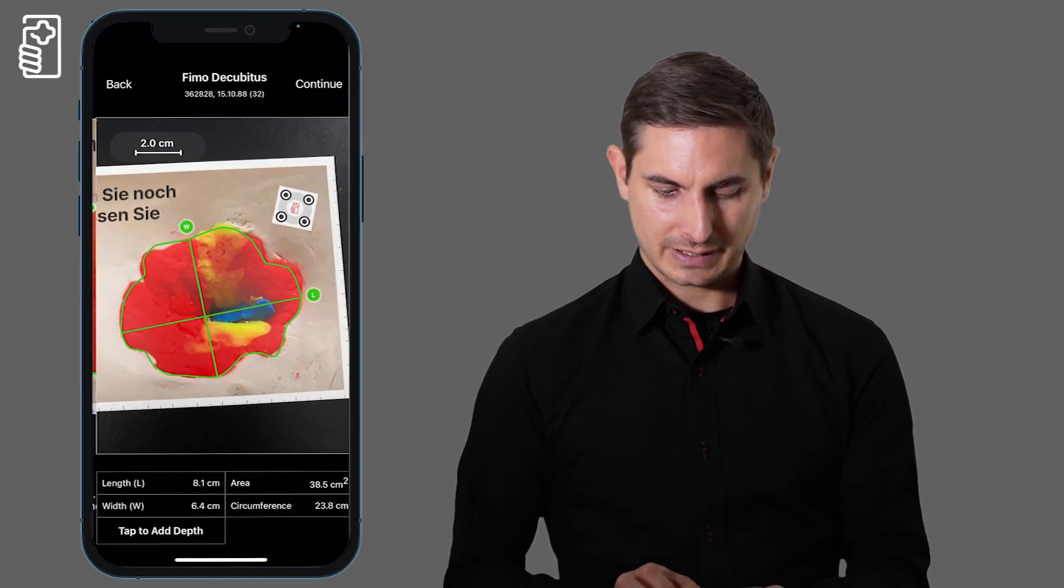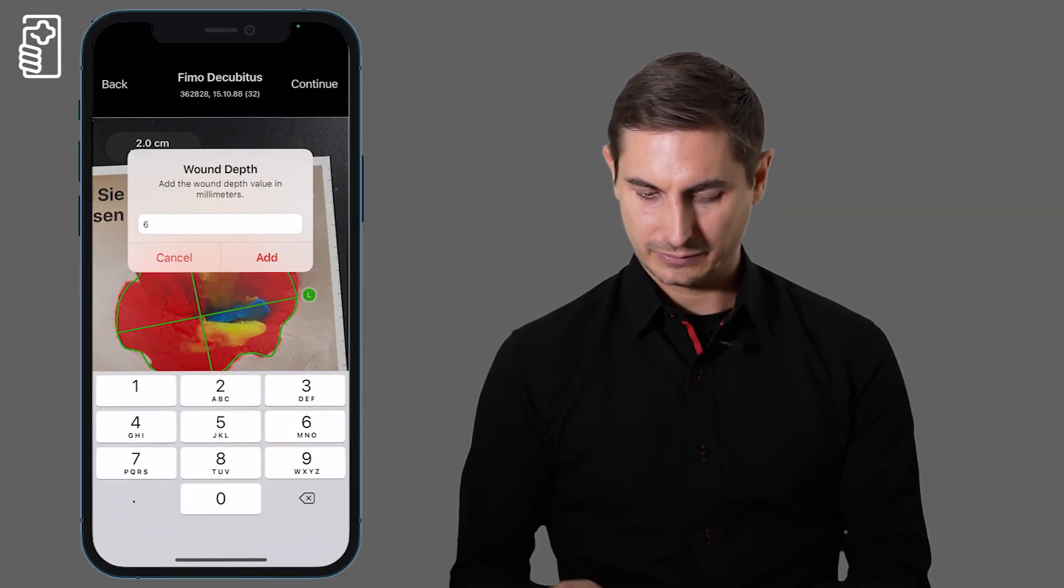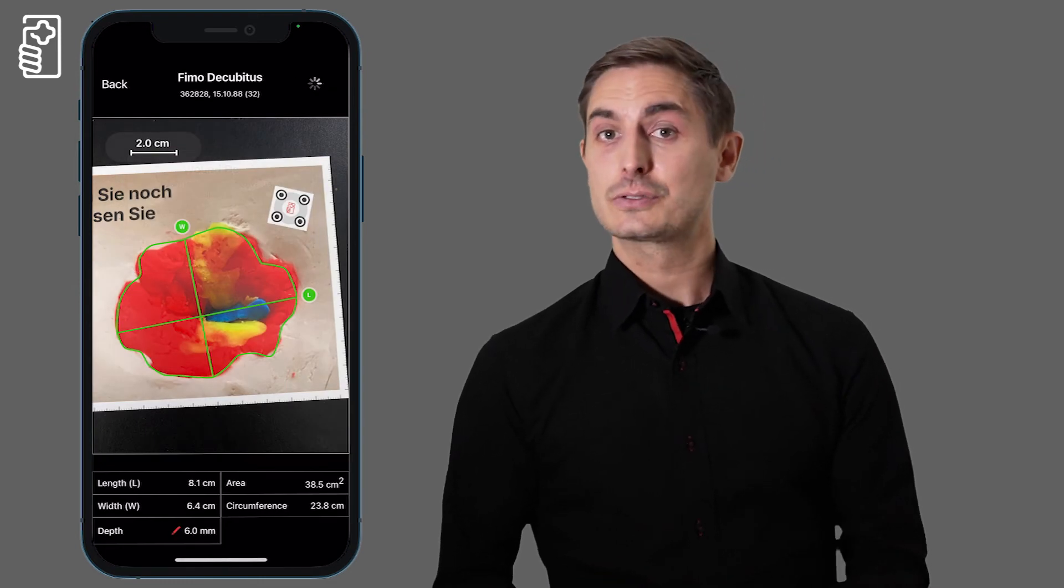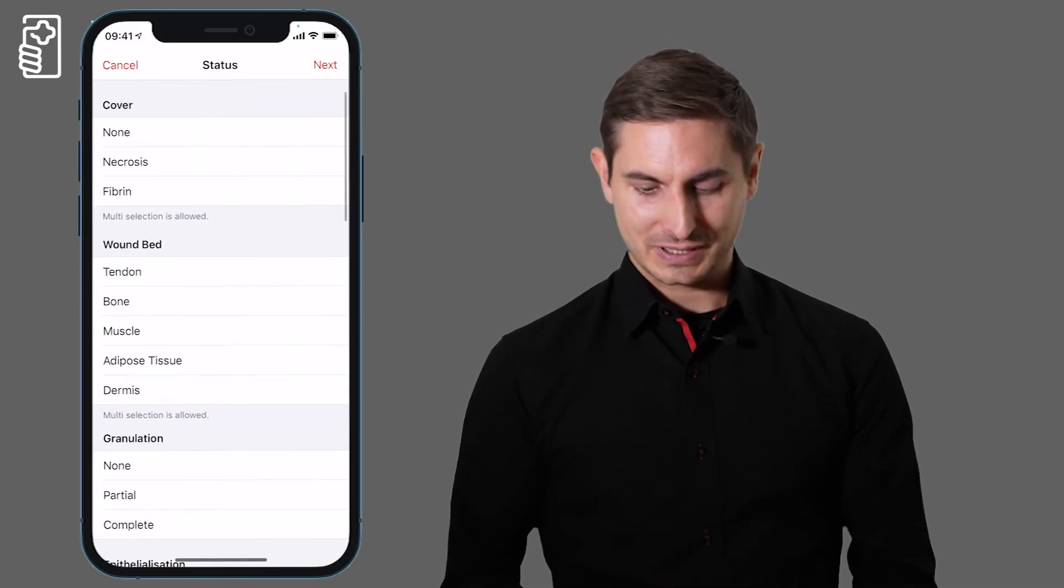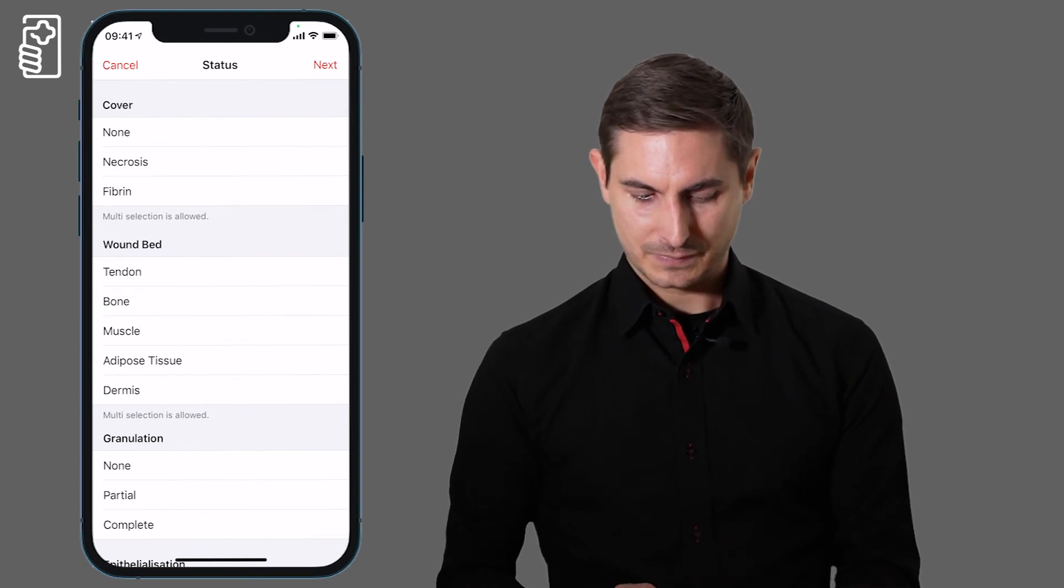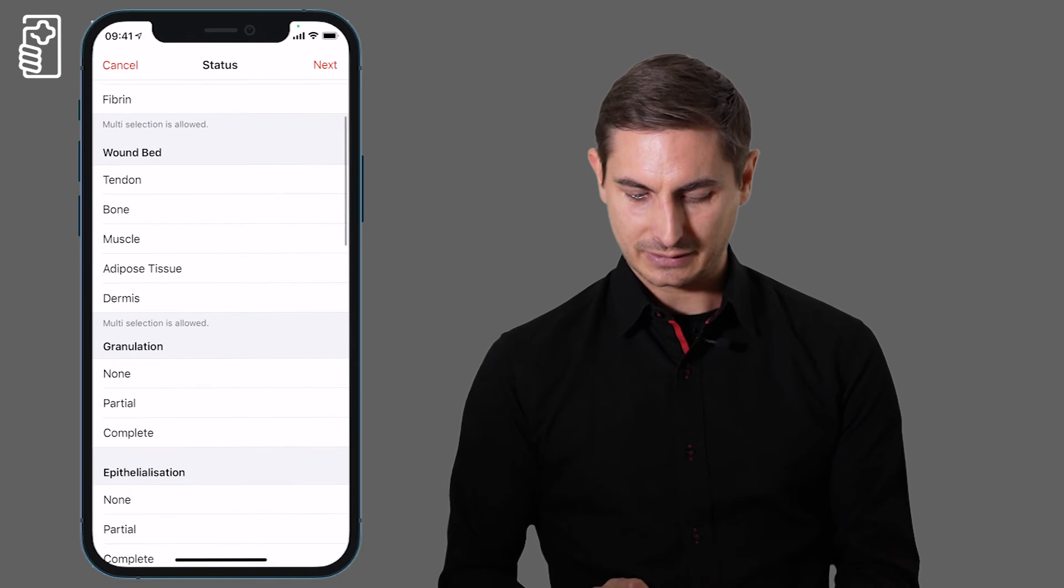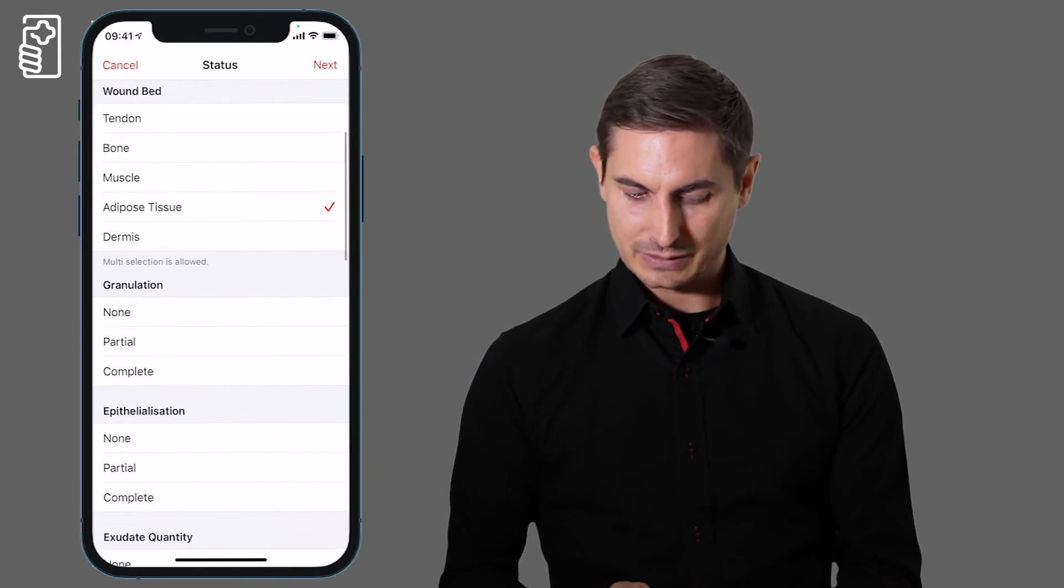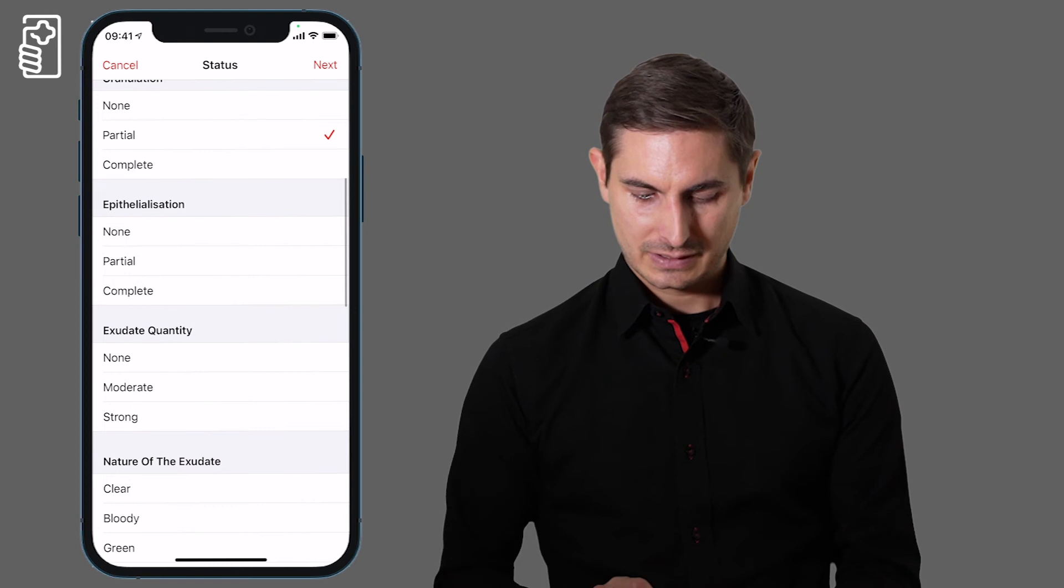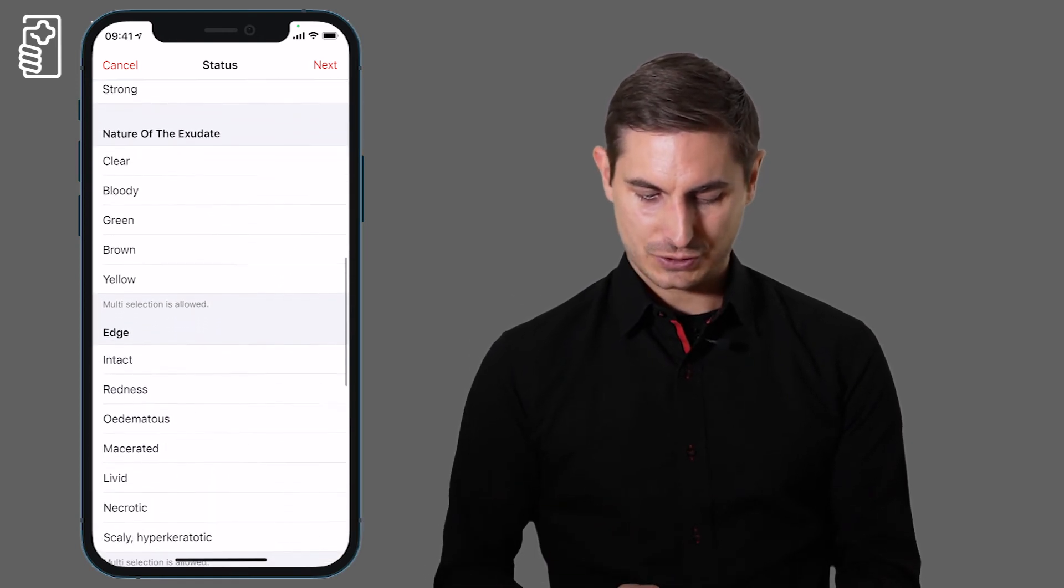Measure the depth if needed and then continue to the standardized documentation of the wound parameters. So the wound cover, the wound bed, the granulation, epithelialization and the wound edge.